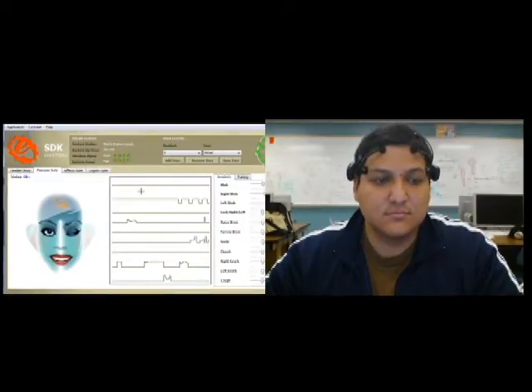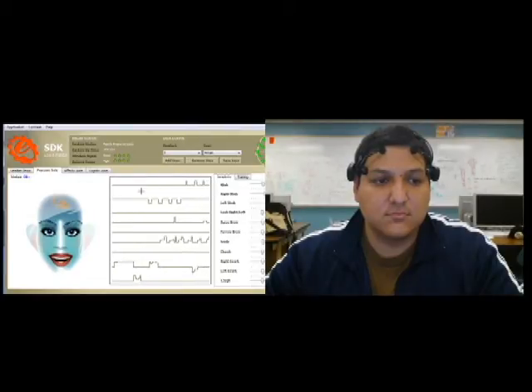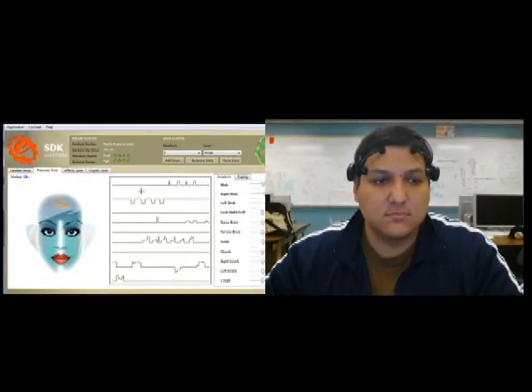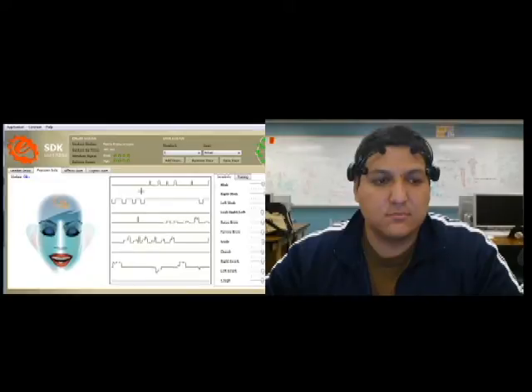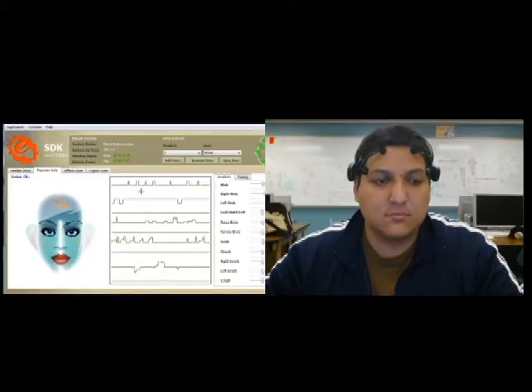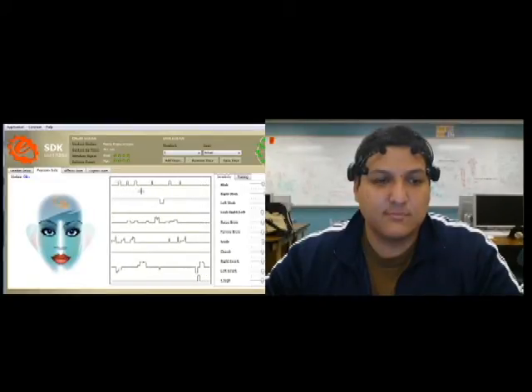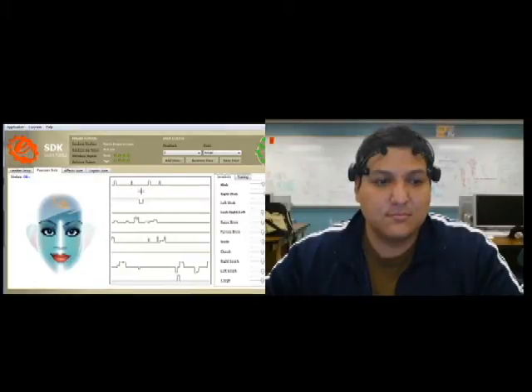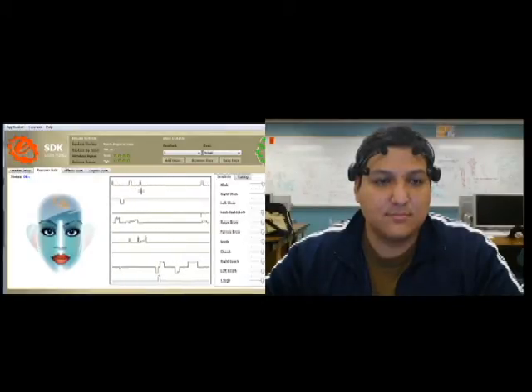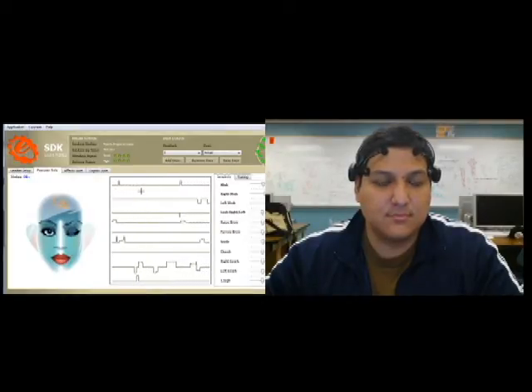The Emotiv suite also has an electromyography tool which detects facial expressions of the user. These expressions can be mapped to keyboard and mouse input, which will be used to insert phrases into text editing software and emulate a mouse.